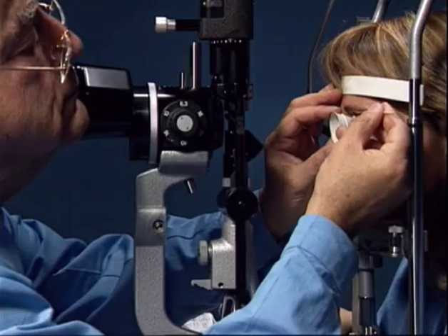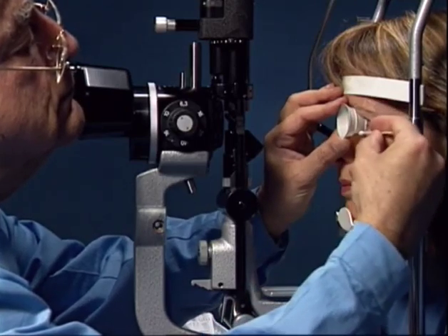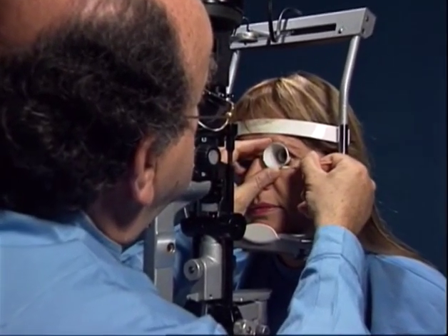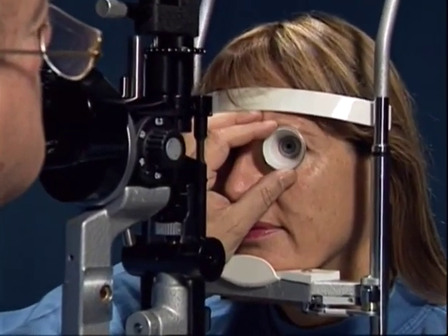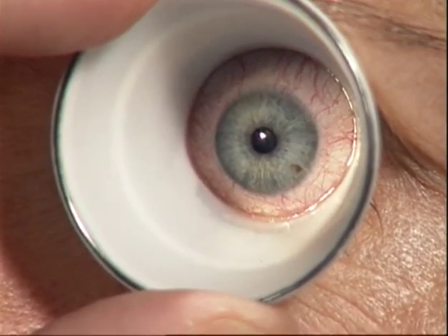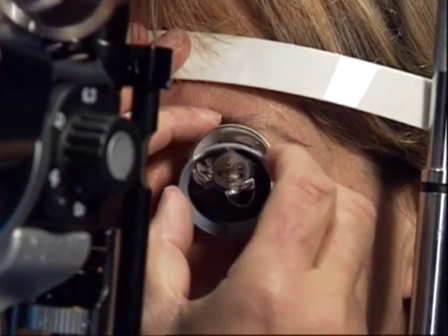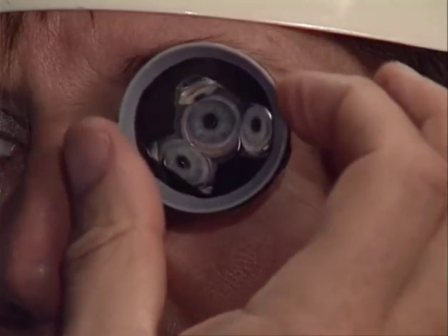Both obstacles which may cause discomfort to the patient can be avoided by the use of an enveloping funnel. This funnel is inserted first, prior to the insertion of the contact glass, if necessary with the aid of a cotton tip. It is inserted in the same manner as a contact glass. The funnel's opening is carefully checked, and any trapped parts of the lid and cilia are retracted. The contact glass is inserted into the funnel. The lid skin is now protected from direct friction of the rotating contact glass.